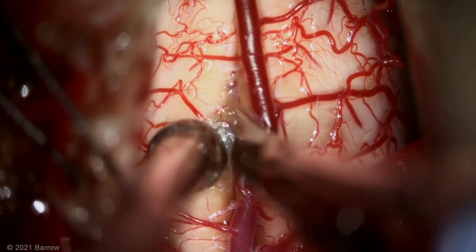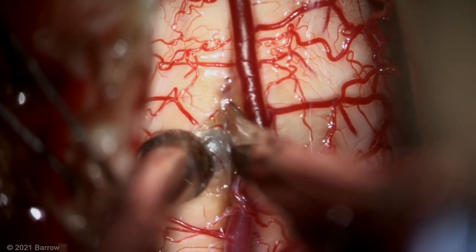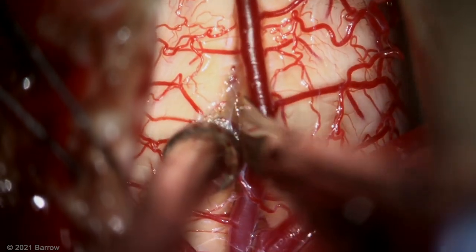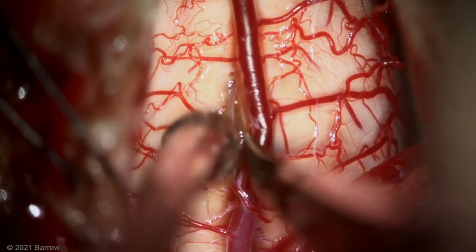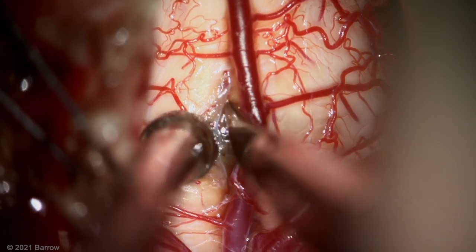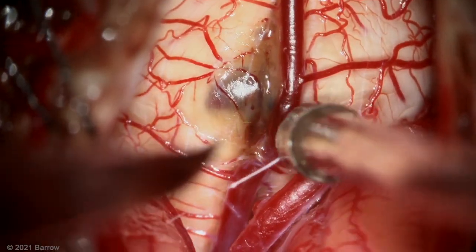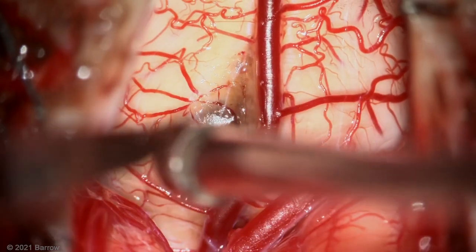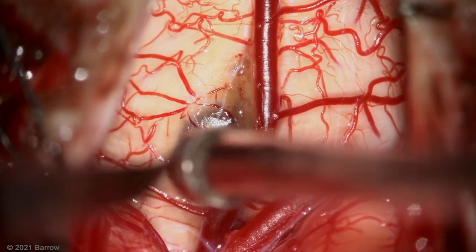Here the posterior median sulcus is being opened by incising the pia overlying it. You can see that the underlying malformation has poked its way to the pial surface just below this midline vein and just below the pia.